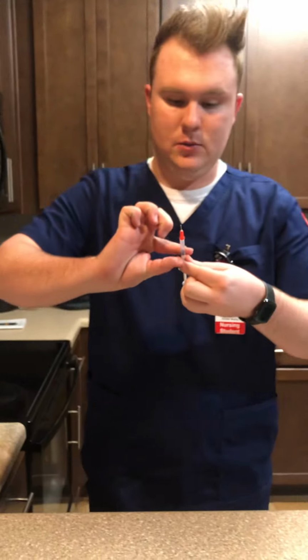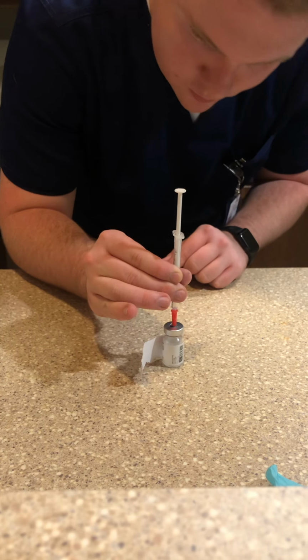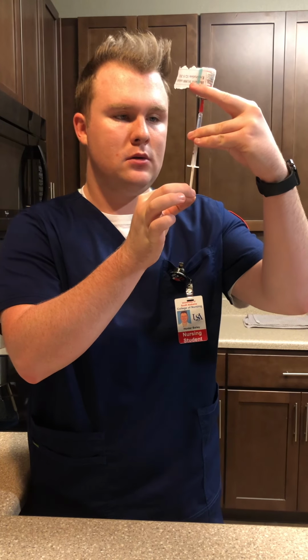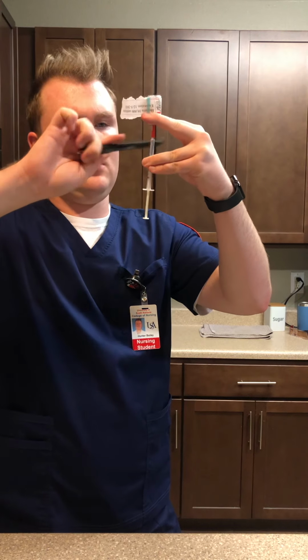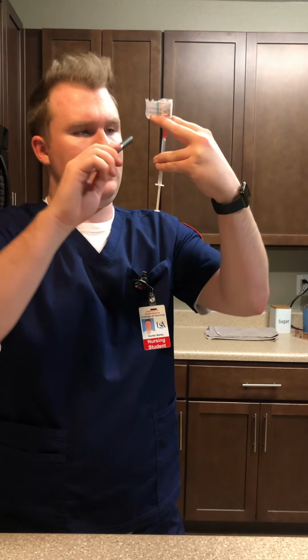So now I'm going to inject this into the heparin. I'm going to inject the air. I'm going to turn it over, and I'm going to draw back more than half a milliliter so I can expel any air bubbles. To get rid of the air bubbles, instead of flicking it, I'm going to use my pen. They're working their way up to the top.